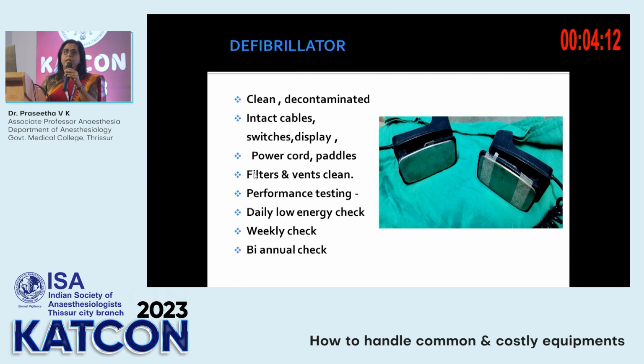And always remember, some equipment which works on electricity has a tendency to heat up. So those machines will be provided with a vent and a fan inside to cool. If you have dust or fibers clogging the vent, the equipment gets heated up and damaged. So always clean the air filters and vents.